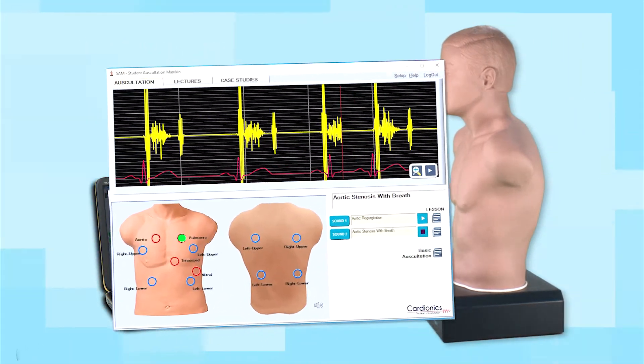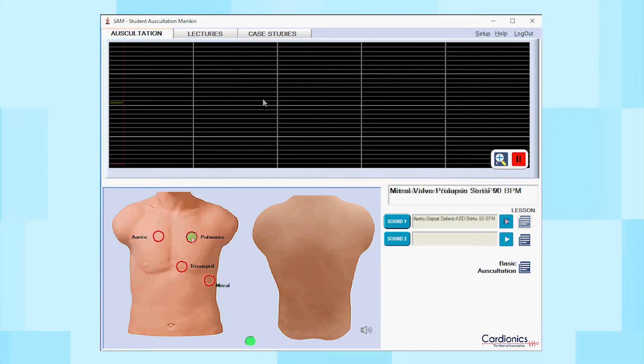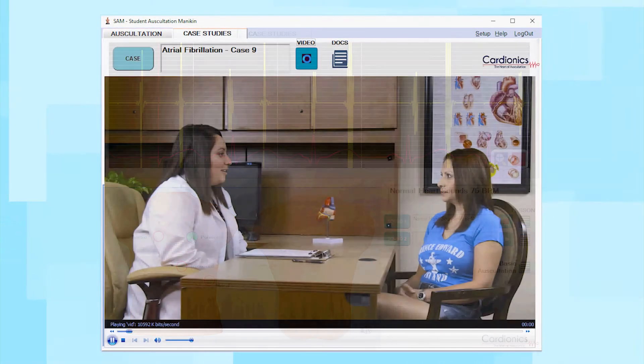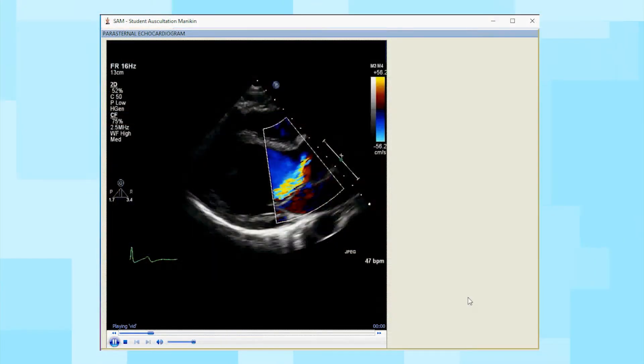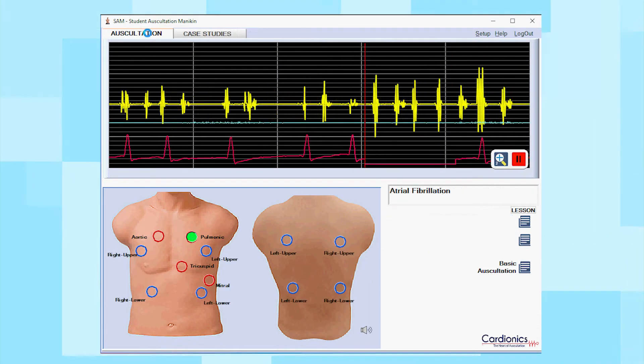SAM 3G's brand-new software interface includes the largest sounds library with real-life sounds displayed at the correct anatomical sites. Programmable and password-protected lessons feature actual case videos, echocardiograms, ECG waveforms, and much more.